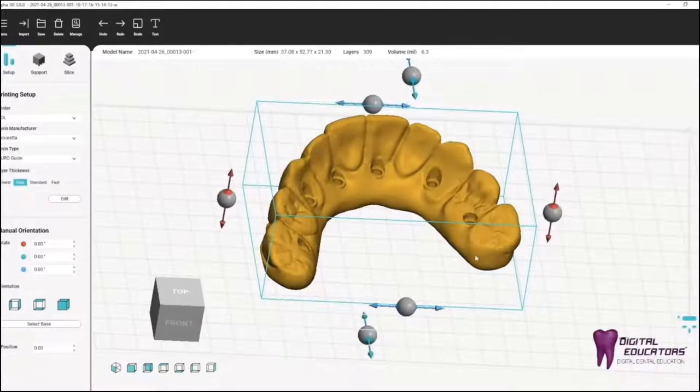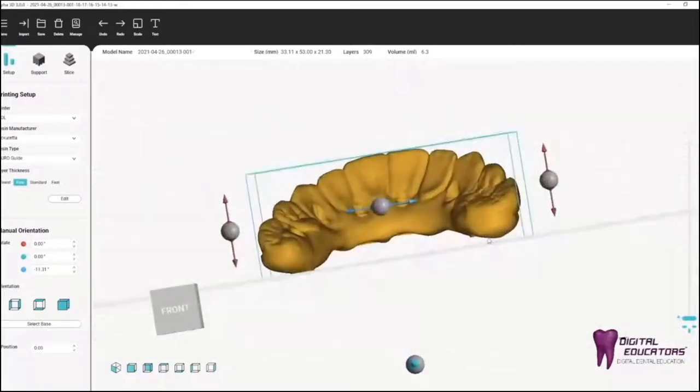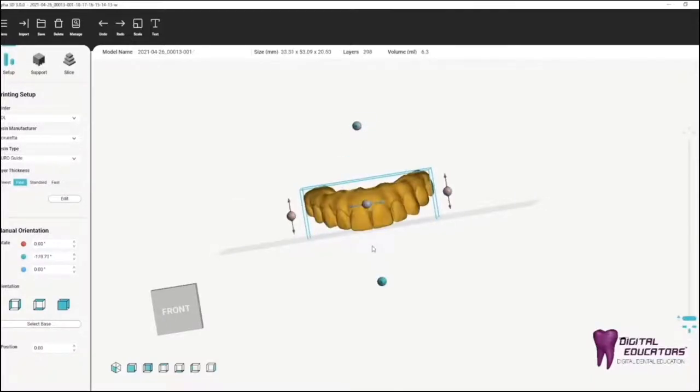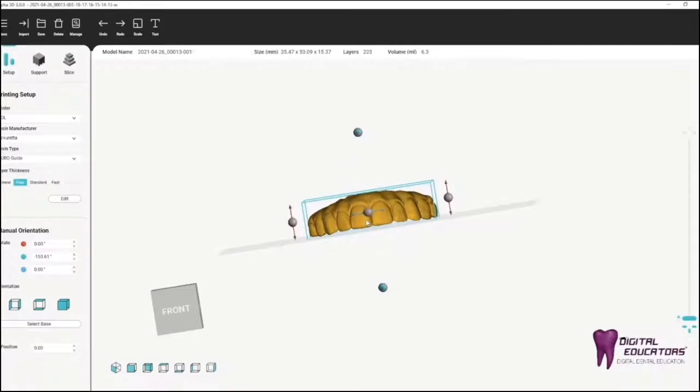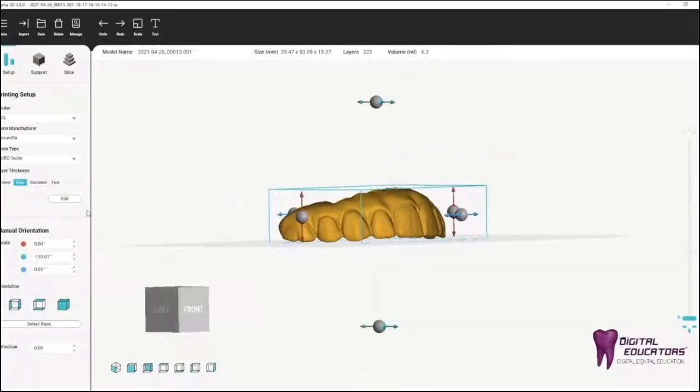So we're going to position the model, and it's important that we position the model so that it will print with the highest level of accuracy, which in my opinion means rotating the model so that the surface where we want the highest level of accuracy, which in this case is the areas that are going to attach to the multi-unit abutments, is printing upright. In other words, they're at the top of the image as it looks here in the software. It's actually going to be printed upside down, so it's actually going to be the bottom of the model.